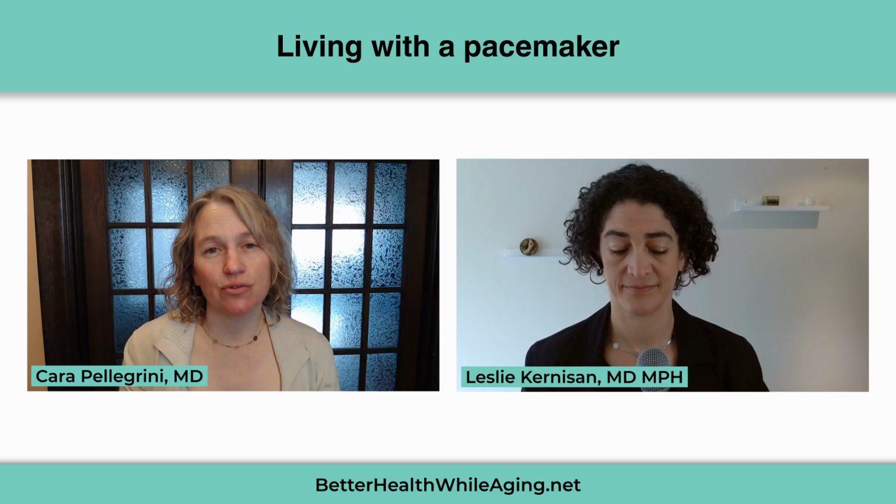I'll also just mention that these days, most pacemakers, if not all that are going in today and for the last several years, are able to have a person still get an MRI, or what we call MRI conditional. So these days, most of these devices don't stand in the way of any other care that you need. And again, the point of this is you get the device and it allows you to get back to and continue the life that you want. So we try and be pretty minimal in any restrictions or recommendations.